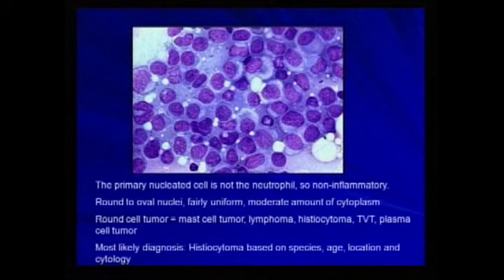And I think this is a lot more key in cytology than it is in anatomic pathology. Okay, it is good to look at these blind to start with, but in rendering cytologic diagnoses, the signalment, the history, and any corroborative evidence is often very important in coming to a final cytologic diagnosis.